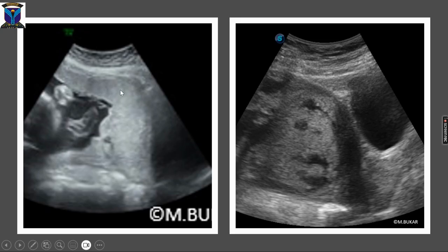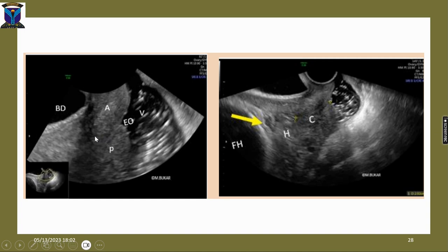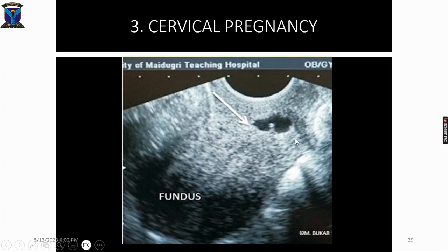This transabdominal image shows placenta previa in a patient with a previous cesarean section — no accreta at 27 weeks. Another case with two previous cesarean sections shows features of accreta. Note the difficulty with transabdominal ultrasound in assessing the cervix in a patient presenting with antepartum hemorrhage. It was difficult to identify the cause, but there was no local cause as far as the cervix was concerned; blood clots were observed between the fetal head and the internal cervical os. This is a case of cervical pregnancy — the implantation is below the internal os line.